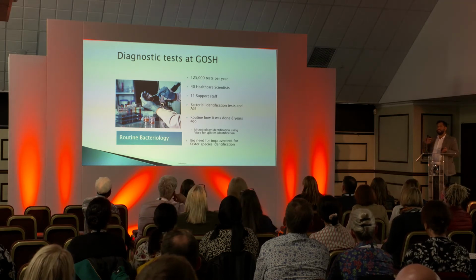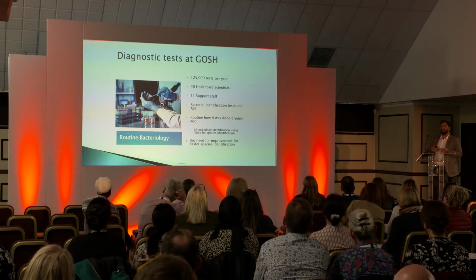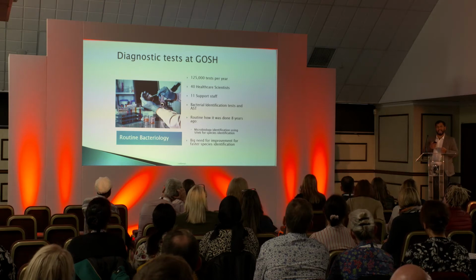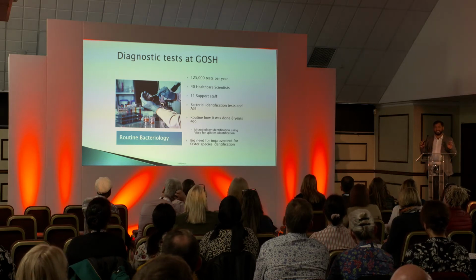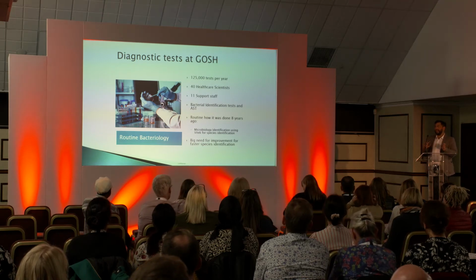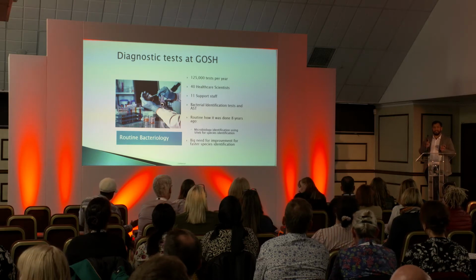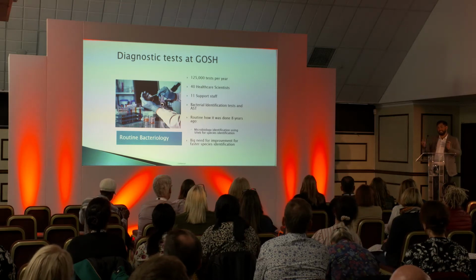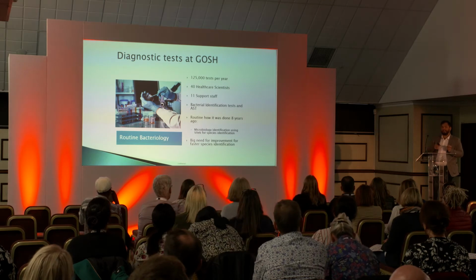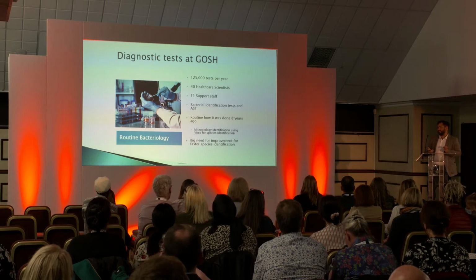So going back to when I first started, when I actually got to Great Ormond Street Hospital, I was like, oh wow, amazing place. But actually, it was quite far back in time in terms of diagnostics and tests. So they use a lot of manual tests. They use something called an analytical profile index, which is a biochemical test. And so when you're waiting for an ID for an organism, it would take 24 hours. And that's quite crucial, knowing that ID, because bacteria can be resistant to certain antibiotics, they can be sensitive to different antibiotics as well. And so when you have that ID, that immediately changes how you manage that patient treatment, etc.